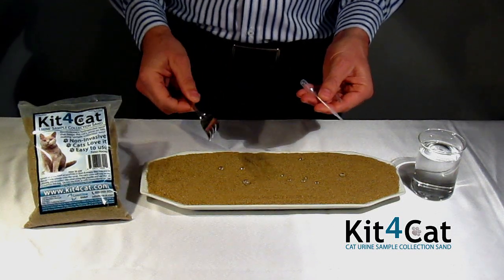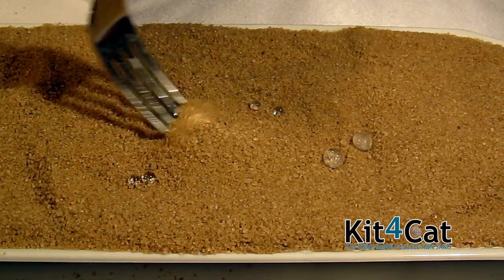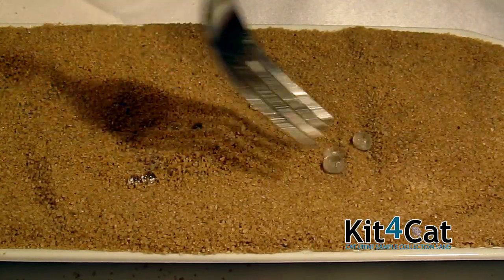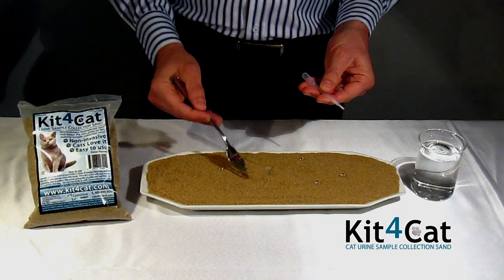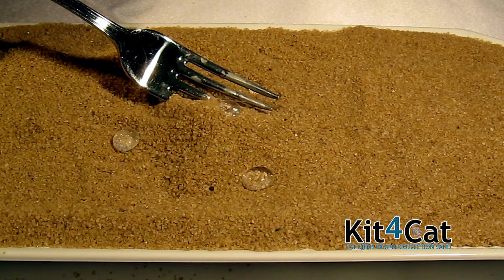Even if the cat tries to move the drop with its paw, the sand will not absorb the drop. Even if the cat covers the drop entirely, we will be able to easily extract the liquid from under the sand.